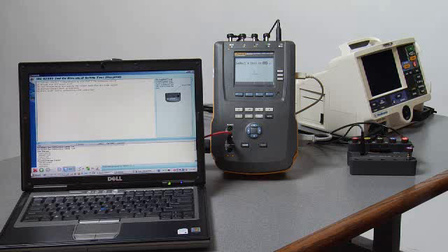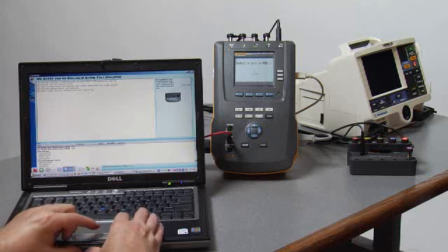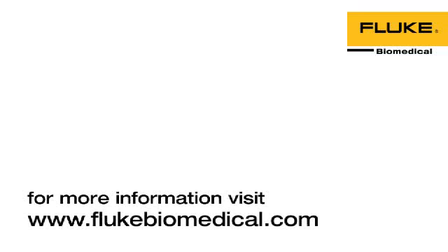As you can see, automating electrical safety testing with test automation systems from Fluke Biomedical is easy. Launching the automated procedure previously created, letting it run through the automated sequence, saving files, and observing results, dropping off reports. Easy as 1, 2, 3.